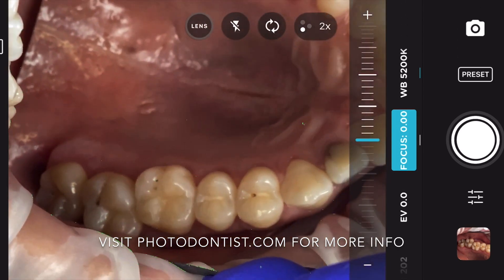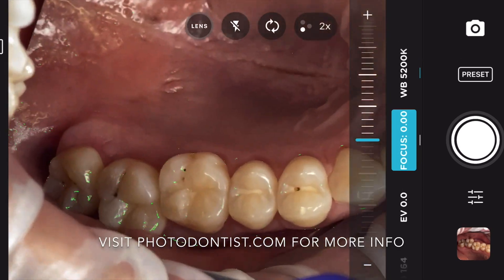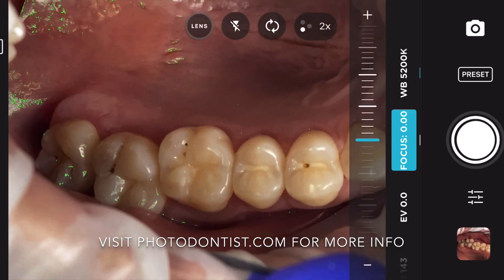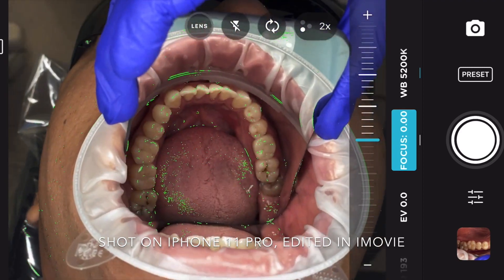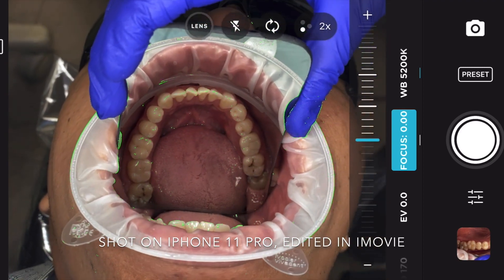We're using my phone rig — you'll get a better look at that a little later — and we're shooting this on an iPhone 11 Pro and editing this all in iMovie. You can see there beautifully the lower arch coming into focus with the neon green dots.